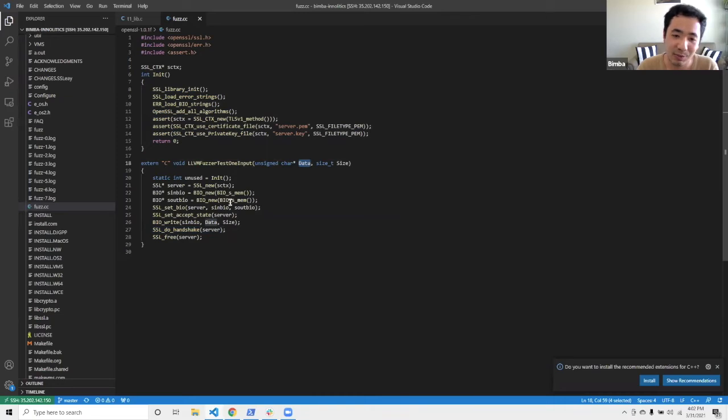Here it's just directly populating the payload with it, but you could use this as a seed to a random number generator, or you could cut it up in different ways and pick out unsigned integers from there. You could do anything. You just get this blob of data. You have to do something with it to test your API.